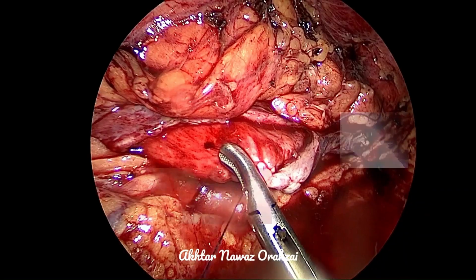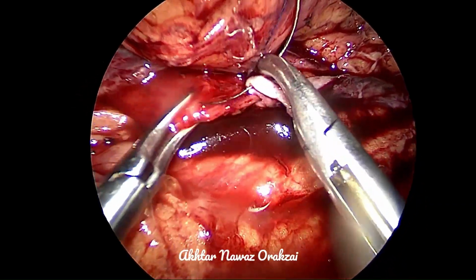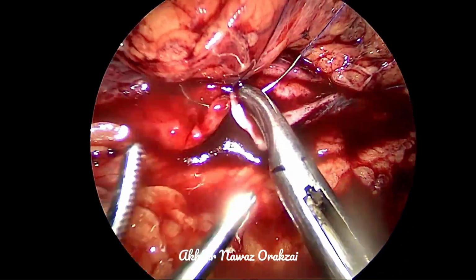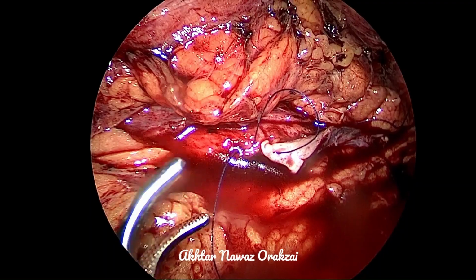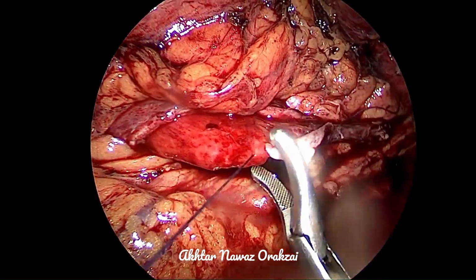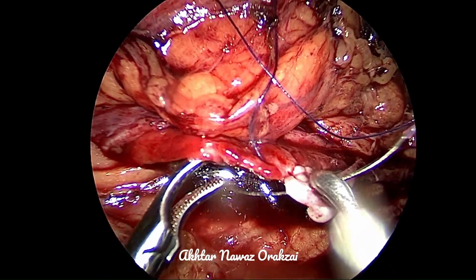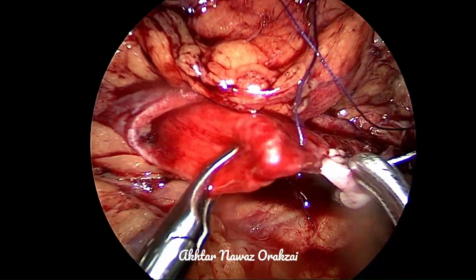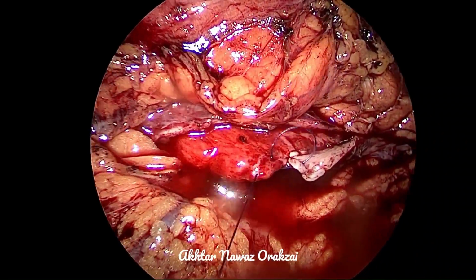So it is really a personal choice and the experience of the surgeon that's going to decide whether one should go for interrupted suturing or continuous suturing. Maybe you can see that we are taking the sutures and then making them tight, and lucky enough, they are not loosening.